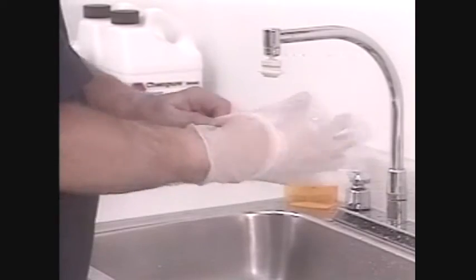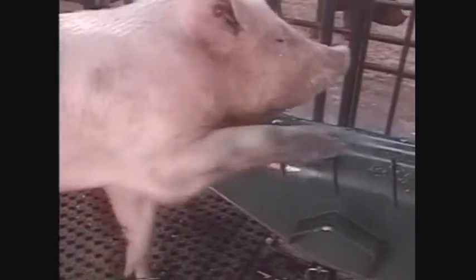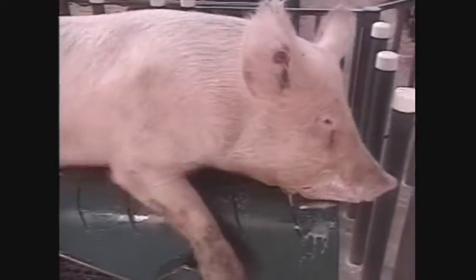The type of glove is a very important consideration, as some gloves are actually toxic to sperm. The best gloves are made of vinyl. Problems with toxicity have been noticed, particularly with latex gloves. Gloves for semen collection should be tested by the supplier to ensure that they have no spermicidal properties.